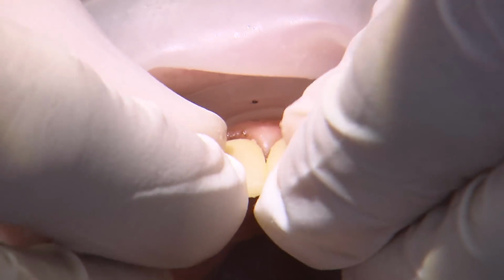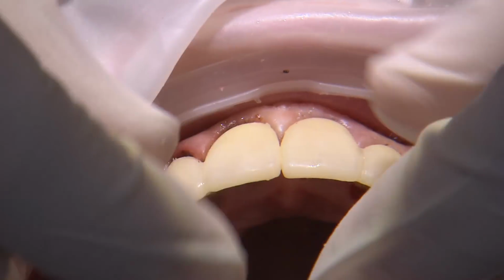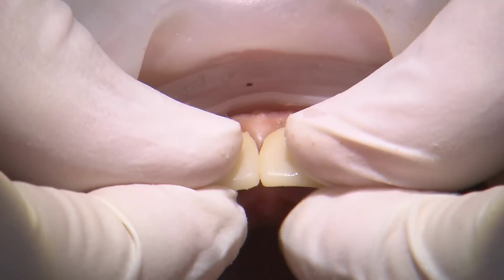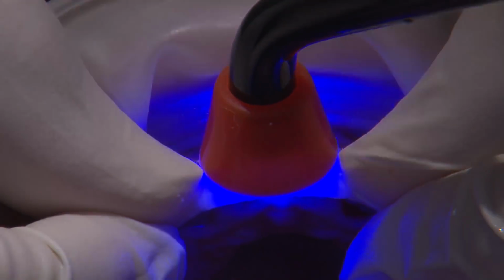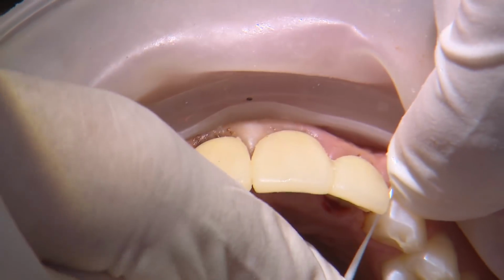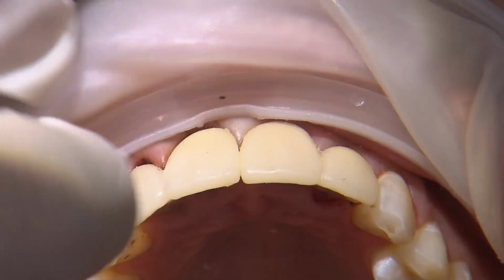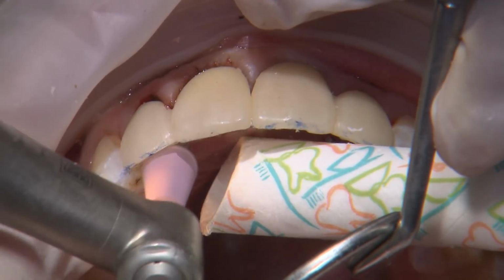I spot etch with phosphoric acid in about a 2 by 2 millimeter area on the labial surface of each of the preps. I then cure a bonding agent directly where I etched and then place a small amount of Camouflage flowable composite on each of these areas and then seat the provisionals. This is the only way that I've been able to successfully keep these in place.